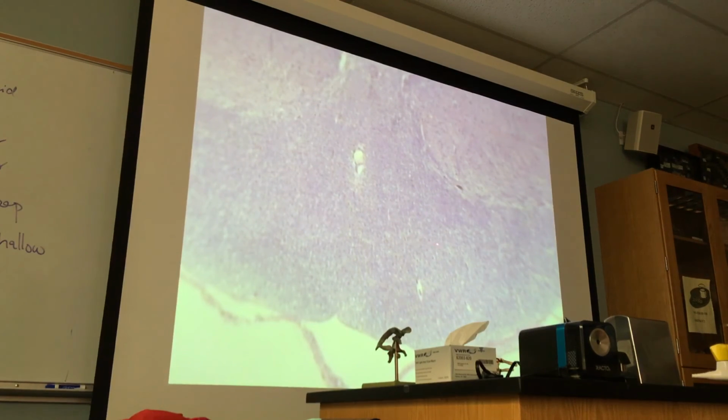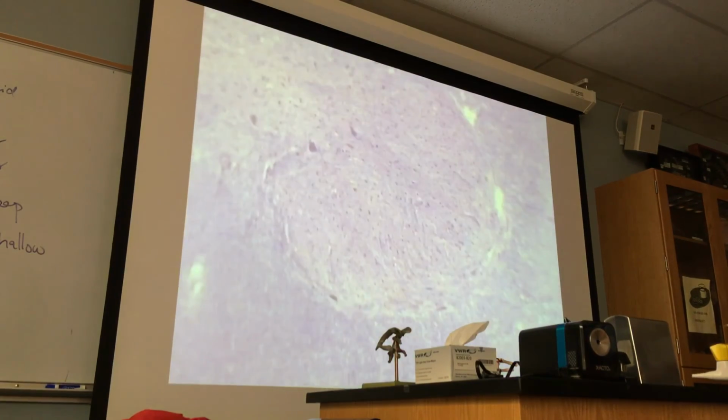You have to complete it. Dorsal white column, or dorsal column of white matter? Either you say dorsal column of white matter or dorsal white column, or posterior white column. Very good. Now, so this is gray matter, isn't it? Yes.